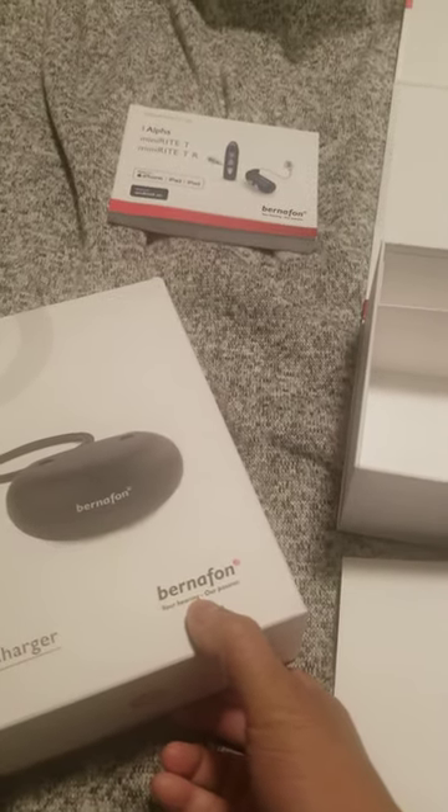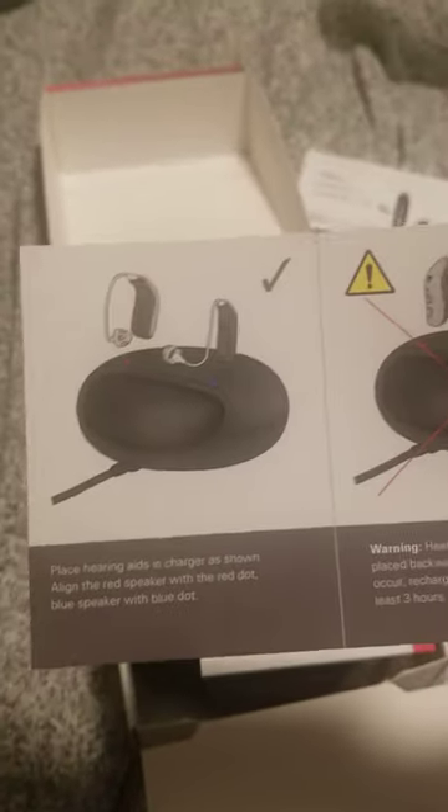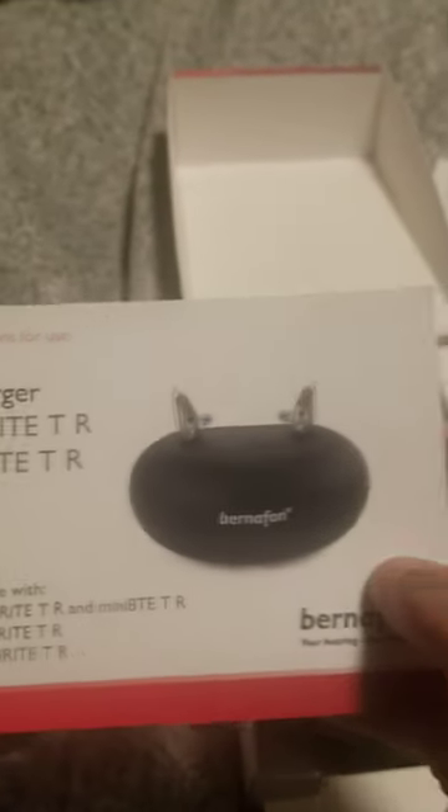Recharge for three hours. Here's the charger and how to use it — instructions to use the charger, a case bag included.